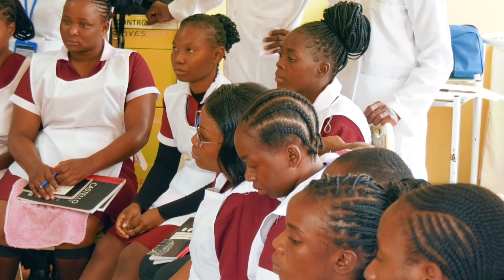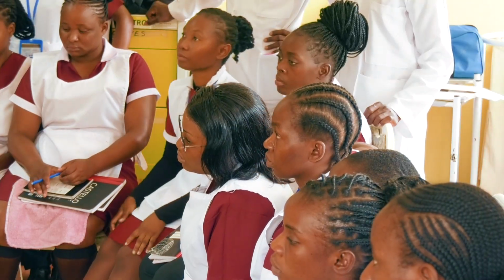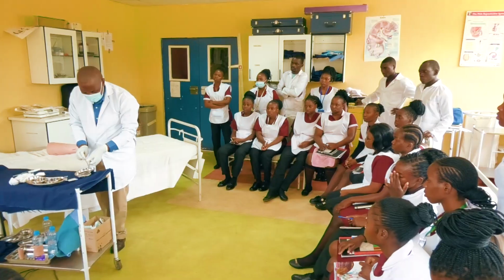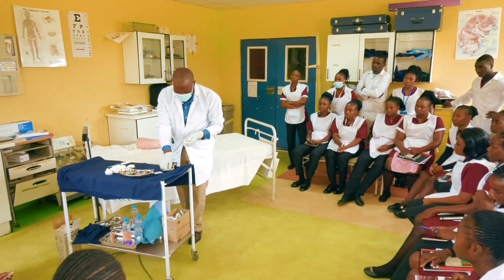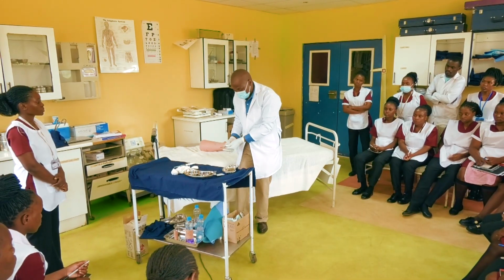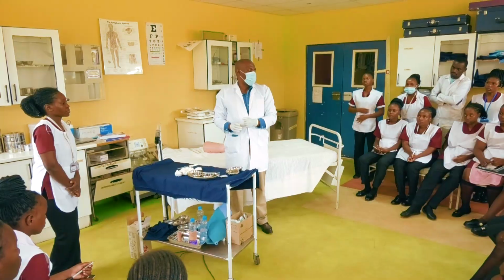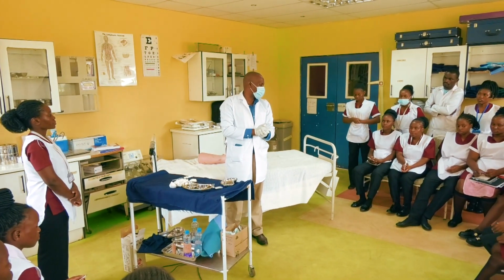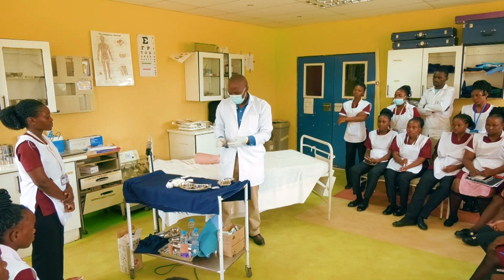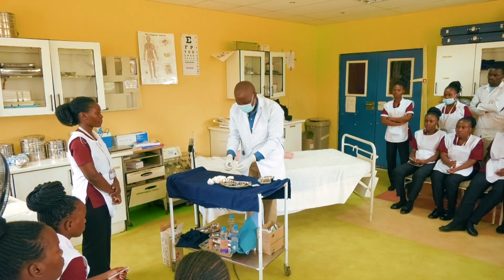So what I said is that the next thing after you are done is the dismantling procedure. In the dismantling procedure, that's where we deal with anything that came in contact with the patient. If this is JIK, I'll put these instruments in JIK. I'll tell my assistant to take note of the time in JIK. For how long are the instruments supposed to be there? 10 minutes. Beyond 10 minutes, we are destroying the instruments.